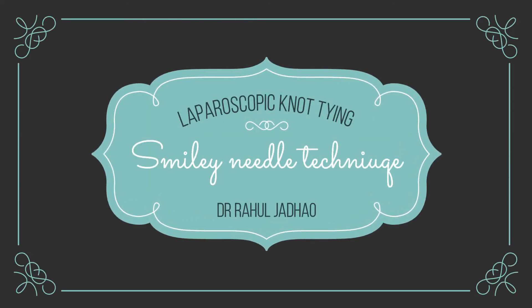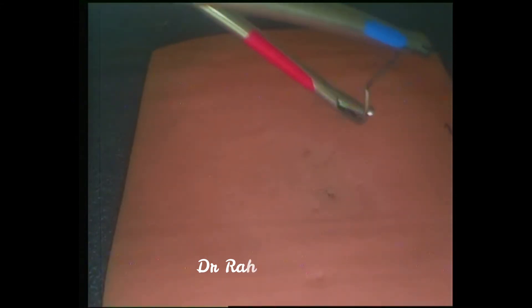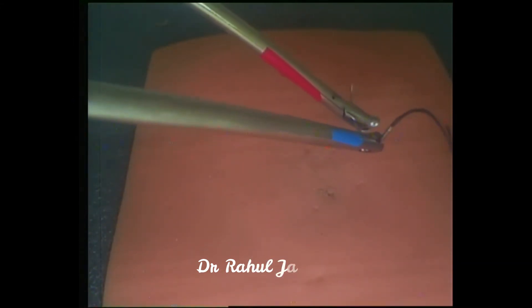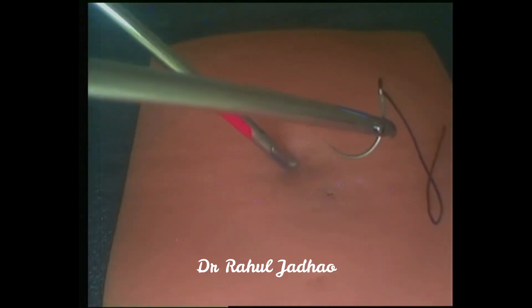This video demonstrates the smiley needle technique of laparoscopic knot tying. When a beginner learns laparoscopic knot tying, they find it difficult to tie a knot with the thread. The swage end of the needle may be used to make the loop, and once one becomes expert, they can go for other techniques like the O-loop technique or C-loop technique.